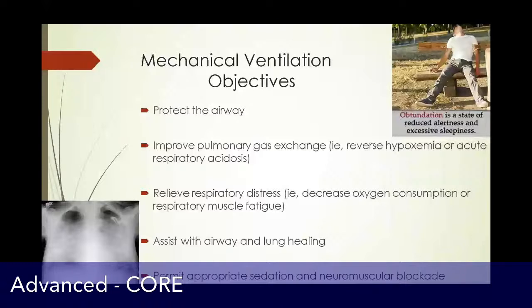If their metabolic demand is outstripping their physiologic reserve, then you're going to have to supplement their oxygen and intubate them. Or if they're too combative, a danger to themselves or others, and they won't let you completely evaluate them, then you may need to intubate them and put them on a ventilator.